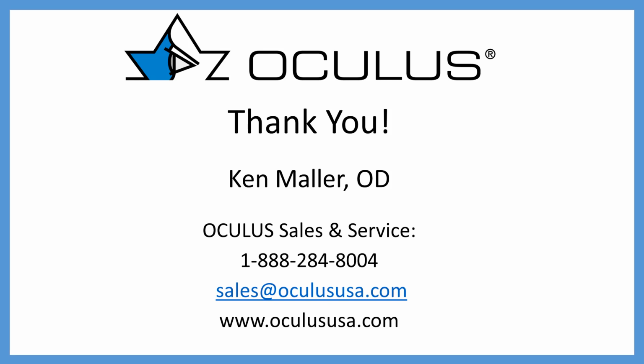And so now it would be truly rare that I don't have an asymmetric flange. Virtually every wave lens I have that's out on the sclera has an asymmetric flange, even if it's a small lens such as a 14.3 or a 14.5, where typically you would think, oh, you could probably get a spherical on there. I don't even do a spherical flange on that. It would be an asymmetric lens.